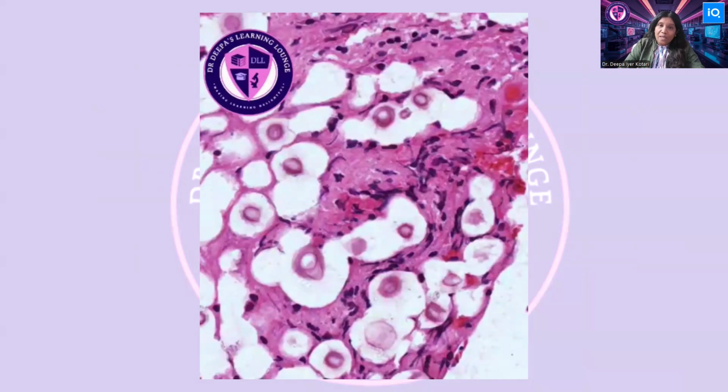In patients with advanced HIV infection, there is often a minimal inflammatory response around these organisms because of profound immunosuppression. Instead, you would just see the organisms accumulated in large numbers, which produces this classical soap bubble appearance that you're able to see on your screen right now. In an immunocompetent person, this appearance may not be there. The person will be fighting off this infection, so there will be a granulomatous inflammation around it, and the number of organisms may be very low, sometimes very difficult to pick up on histopathology at all.